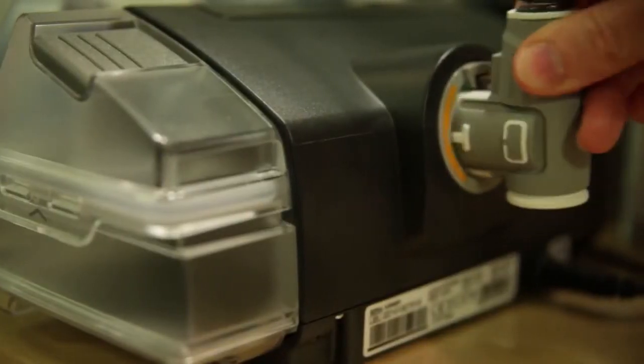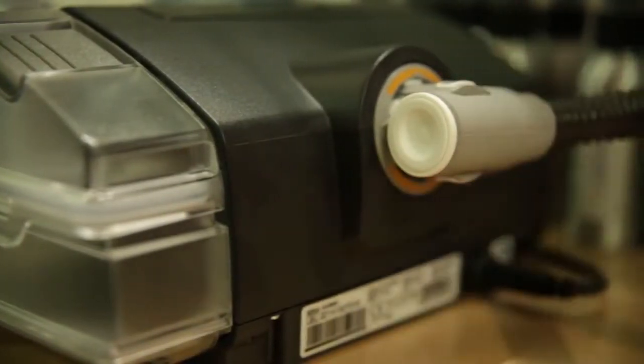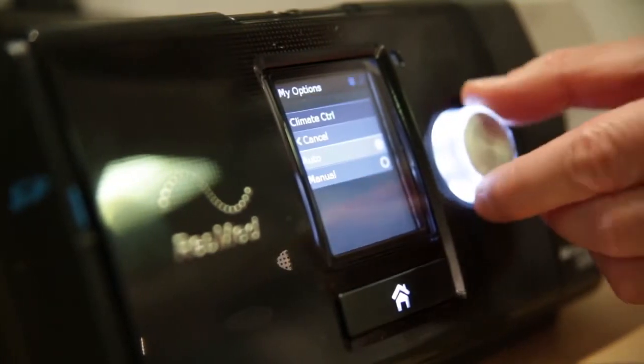On ResMed's previous machines, I always had humidification, which my very skinny and dry nostrils needed, especially in the places I've worked. The humidifier in my Essence 10 is much easier to use. There's only one way you can put it in — you can't put it in inside out, back to front, or upside down. It fits if you're putting it in properly and it doesn't fit if you are not.